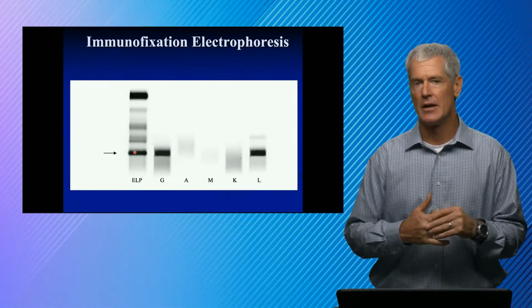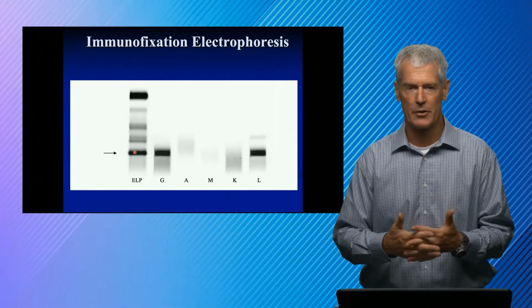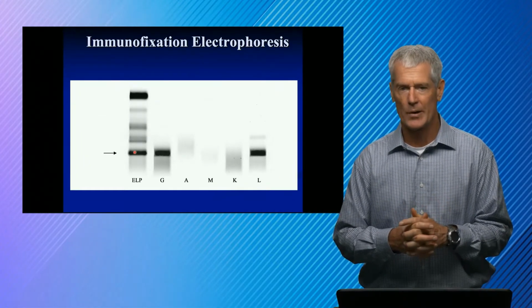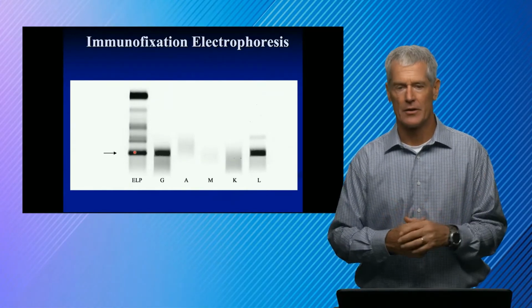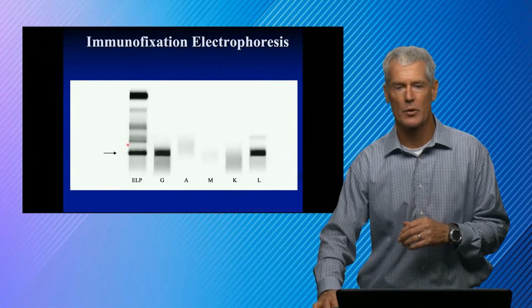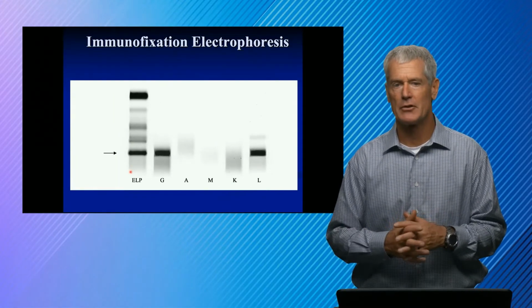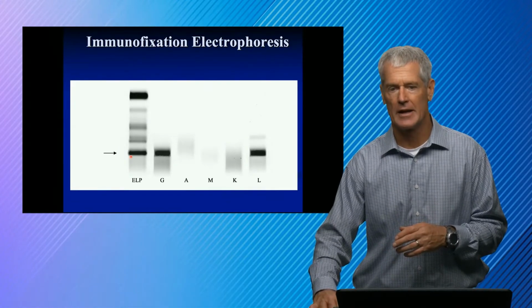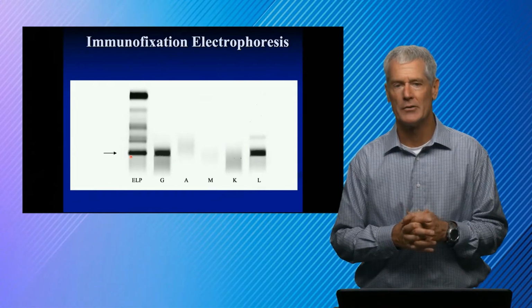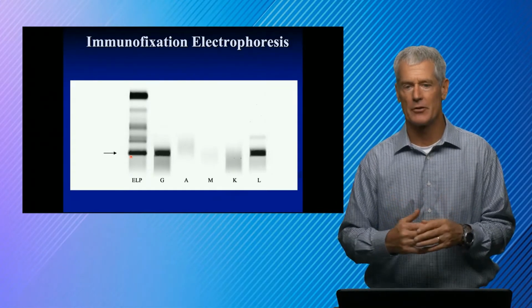Monoclonal proteins can indicate cancer. Multiple myeloma is the most common, followed by Waldenstrom's. And then a variety of other conditions. But we're concerned whenever we see a monoclonal protein. And so this patient sample was probably screened by SPEP. They found this monoclonal protein and they wanted to figure out which one it was. And so that's what IFE does. It tells us which immunoglobulin is present.